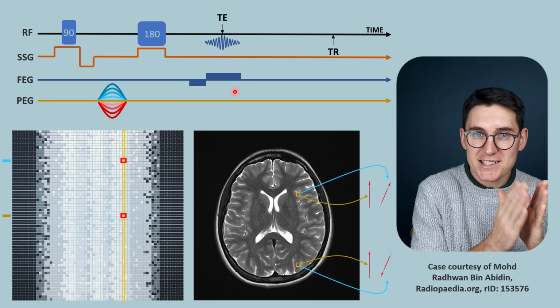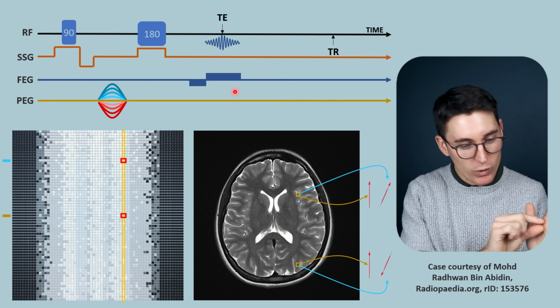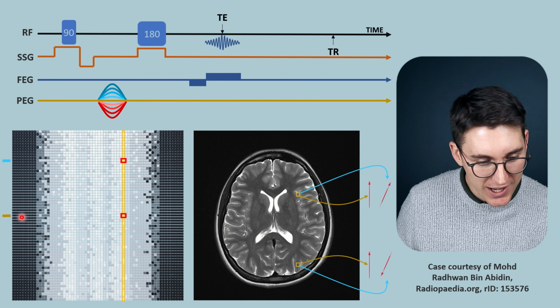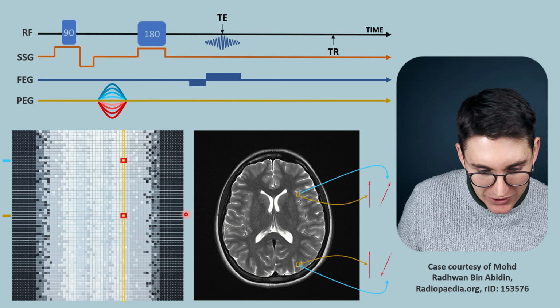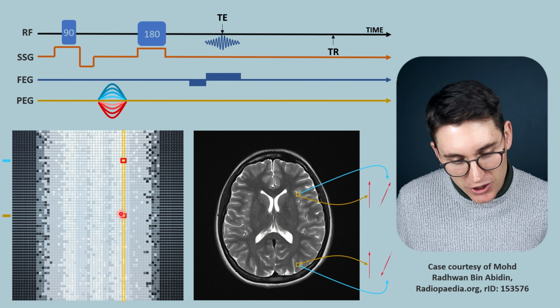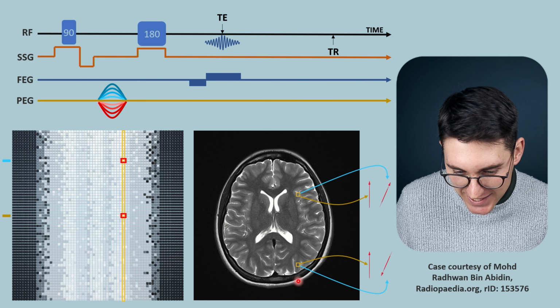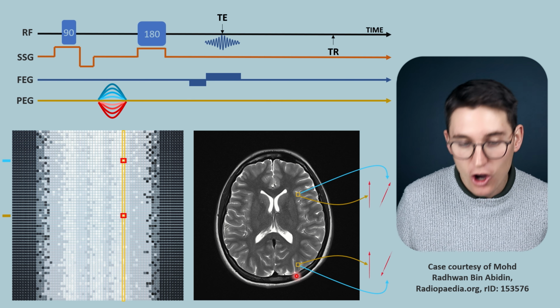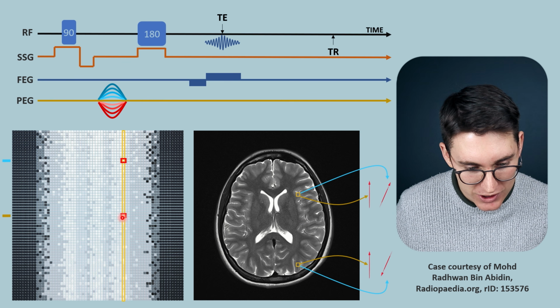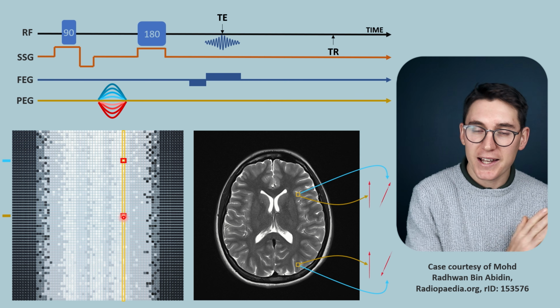Remember, K-space is taking that analog signal over a period of time, and we're using all of that K-space data to frequency encode and make the data that is acquired along this line of the frequency encoding data space. So this data point here represents all of the signal coming from the x-axis at this location over the entire data acquisition sample. So we can't use this data point alone because this data point is the accumulation of signal over time.